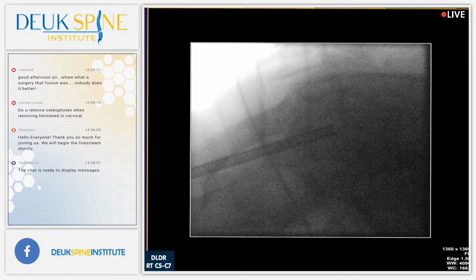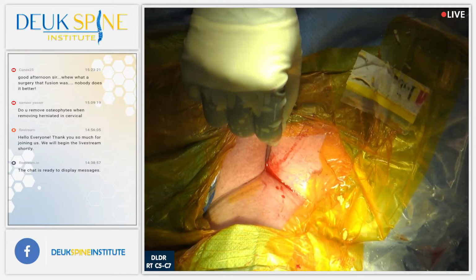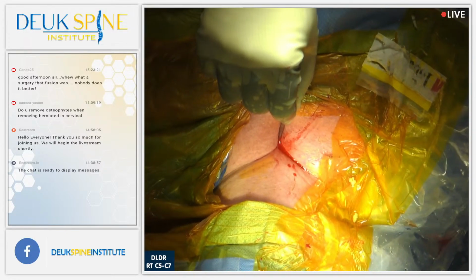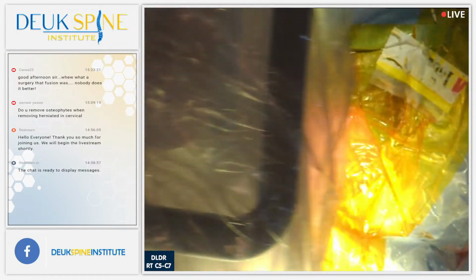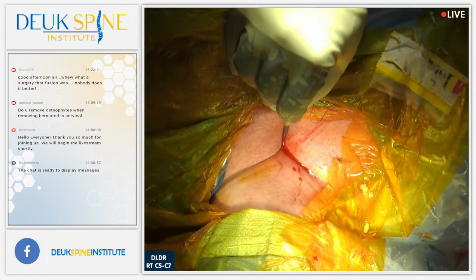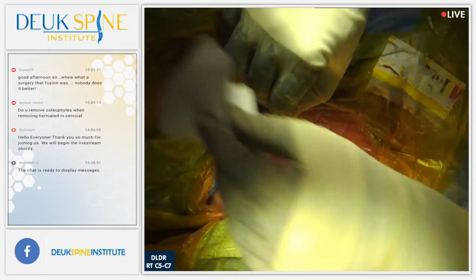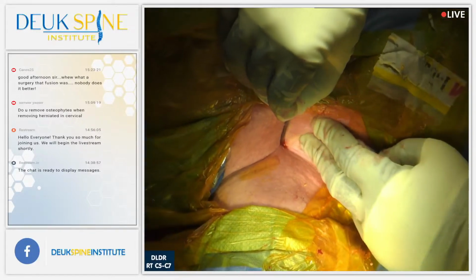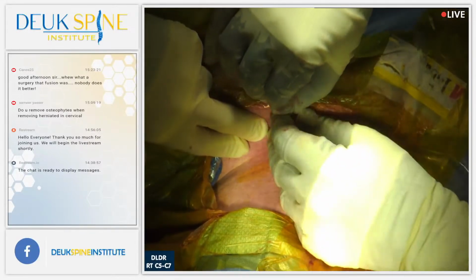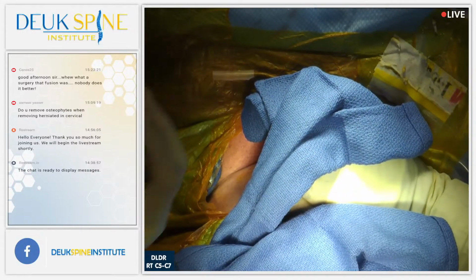See this right here? Look at that. We're fighting his clavicle. There's nothing we can do about that. That's his collarbone. I can't get any further down. This is the best we can do. Is it good enough? We won't know until he wakes up and tells us. We're going to have to make it quick so that we don't get any issues with the skin.